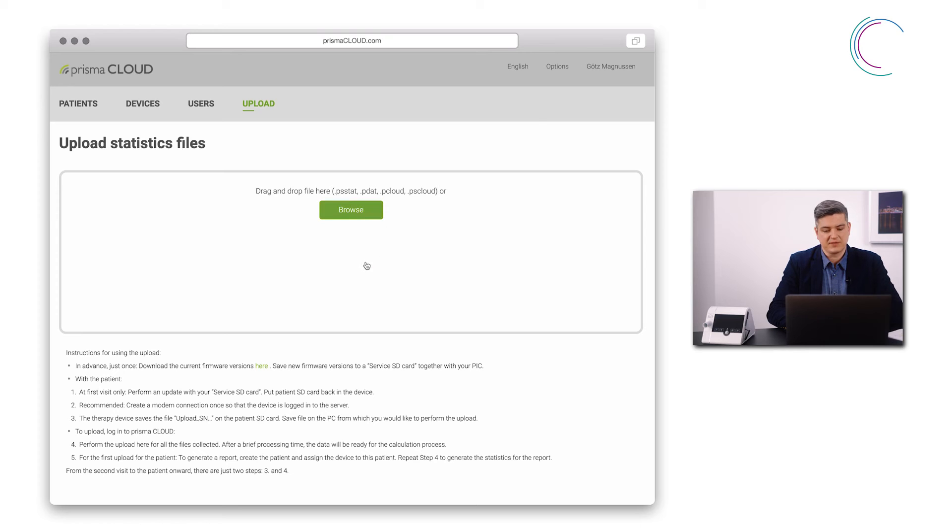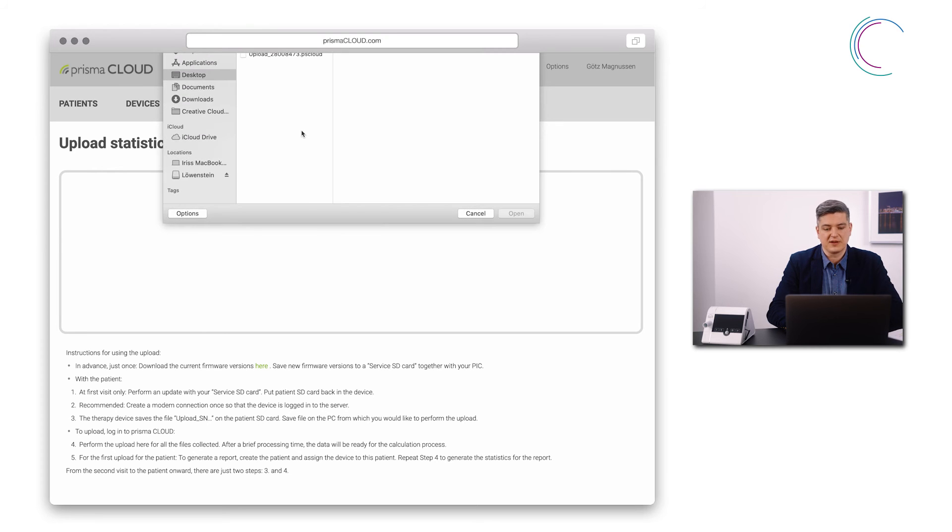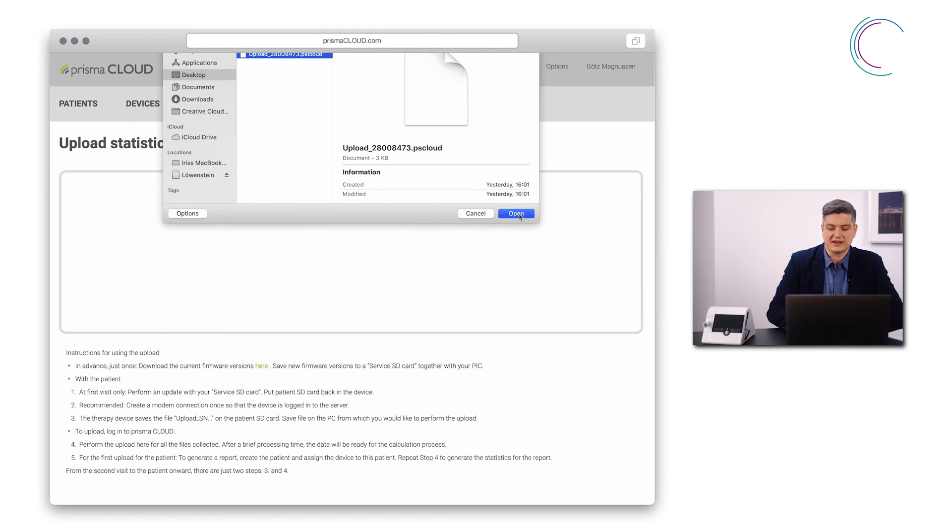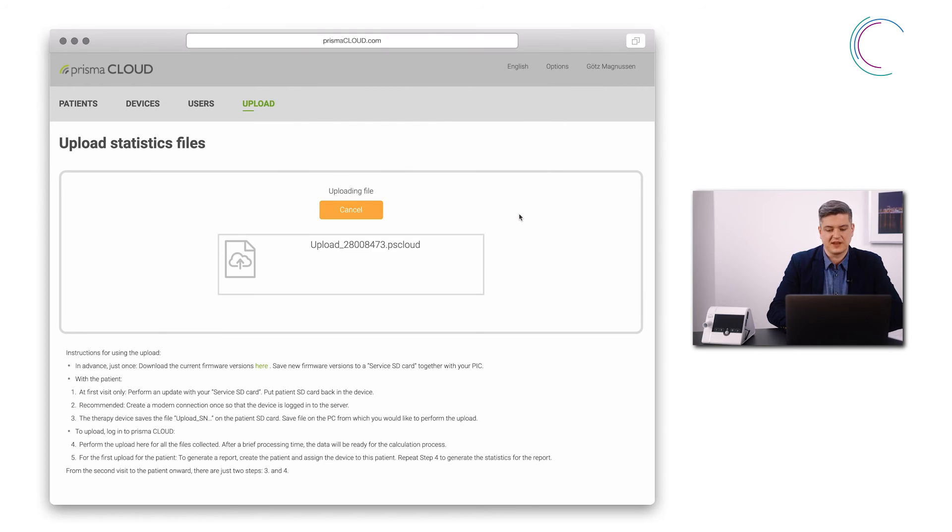Click Browse, navigate to your SD card and select the correct statistics file. Select it and click Open. The upload will start.